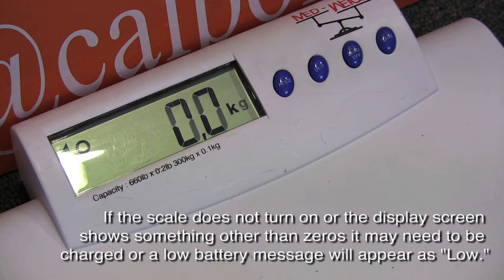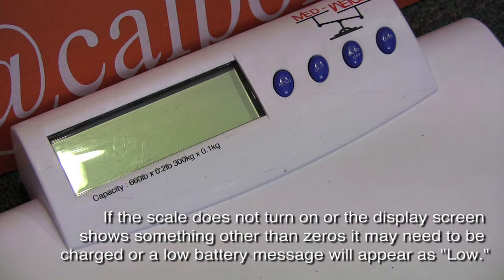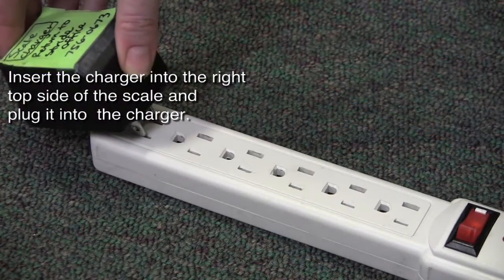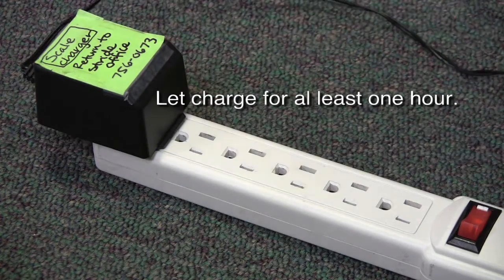If the scale does not turn on or the display screen shows something other than zeros, it may need to be charged, or a low battery message will appear on the screen as "low." Insert the charger into the right top side of the scale and plug it into an outlet. Let it charge for at least one hour.